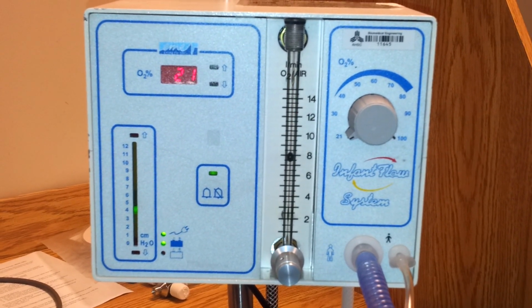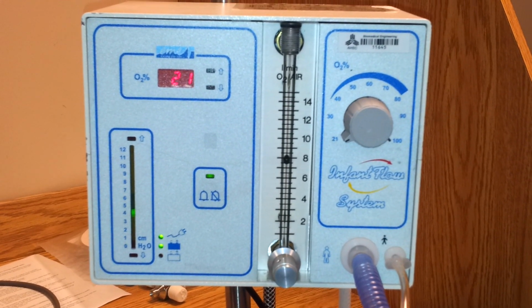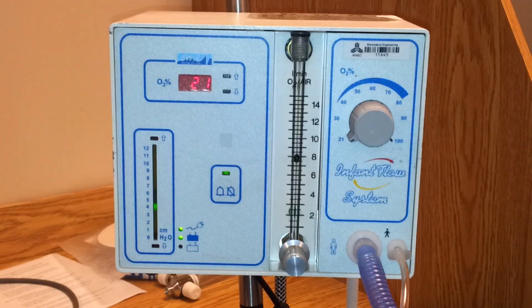The only real contraindications for it are pneumothorax, diaphragmatic hernia, and choanal atresia. So we're going to go over the setup now. So we already have the baby hooked up.